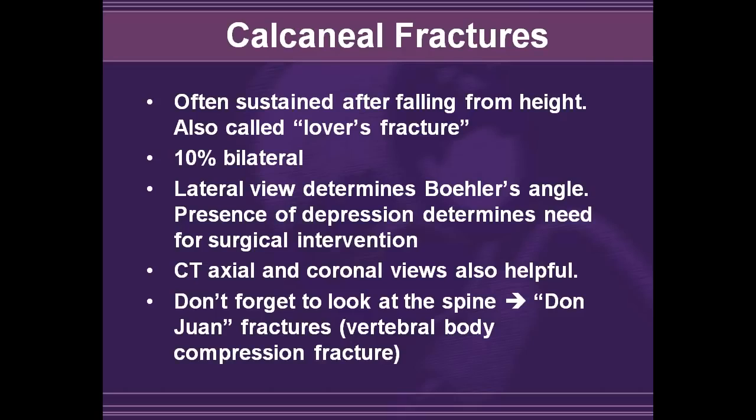Calcaneal fractures are often sustained after falling from heights. These are called lovers' fractures, apparently Romeo and Juliet type of situations where the guy would jump out when Juliet's dad would come in the room.